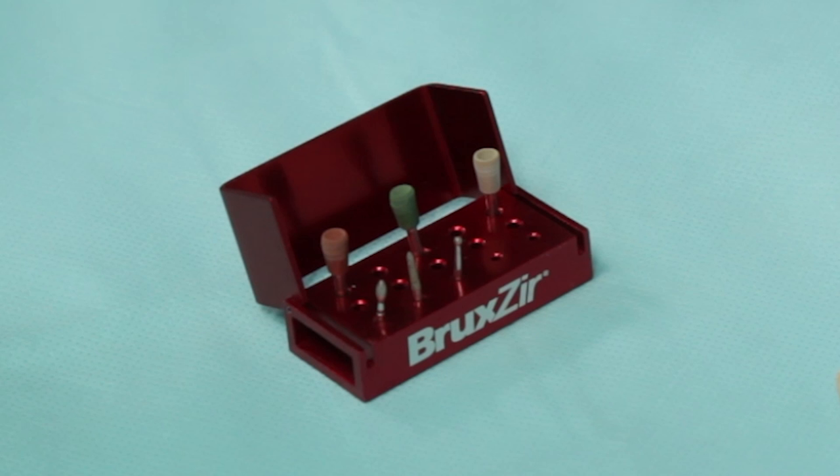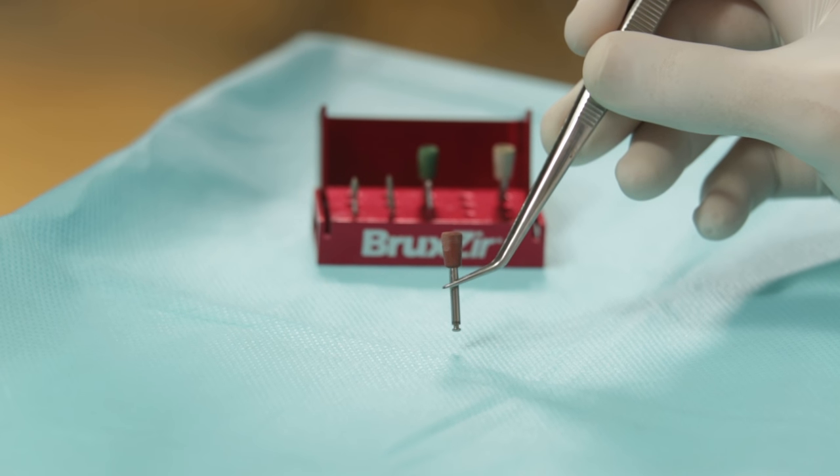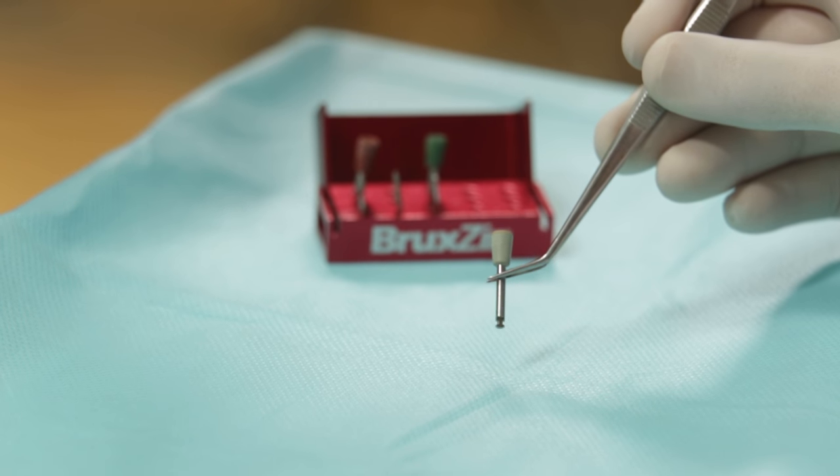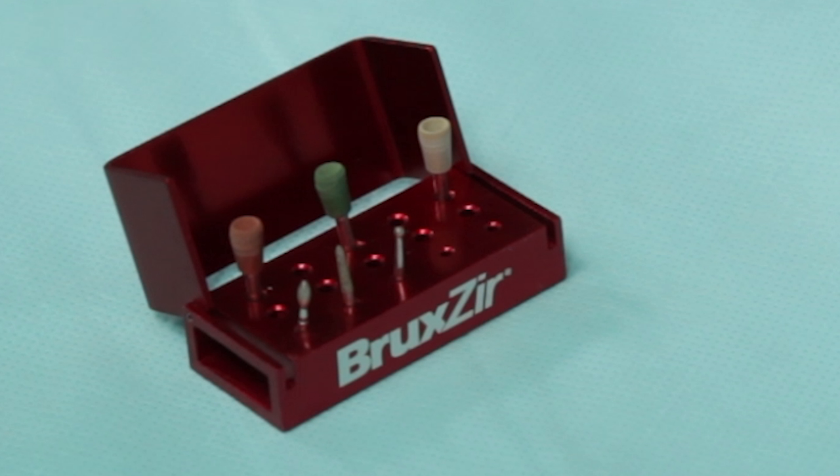The common thing about these burs is that they are all fine-tipped diamond burs, as I had explained in one of my earlier episodes. We also have three different coloured polishing cups which are impregnated with different grits of diamond particles. These actually last really long, and you can see that I have been using these quite a lot.